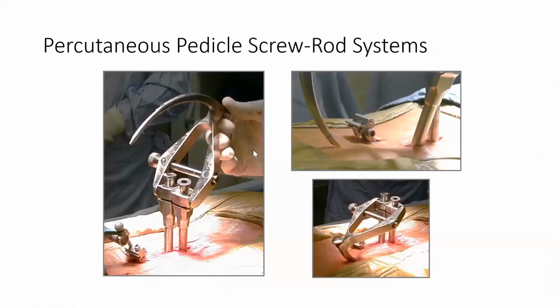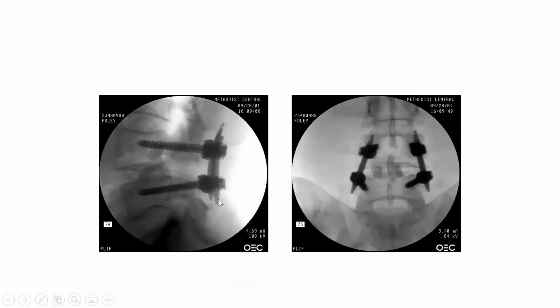So there are some systems where you can go percutaneously. This one's called a Sextant, where you can basically put the screws through stab holes, and you rotate this curved rod in that delivers a rod into your screw heads, and you end up with a percutaneous system. You can even do the cage percutaneously through smaller holes. You basically end up with a whole lot of puncture holes in the skin, and lots of damage inside, almost the same as if you did open surgery.